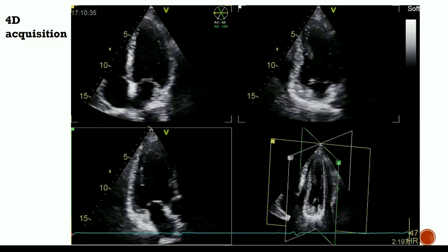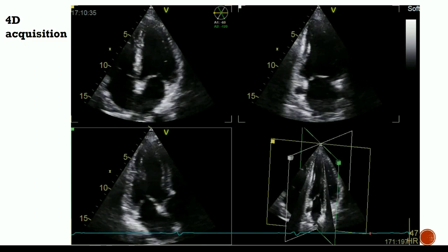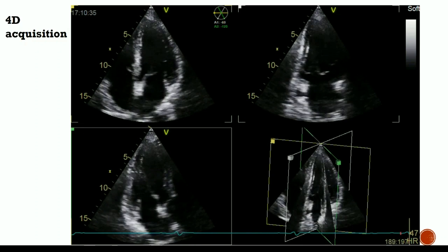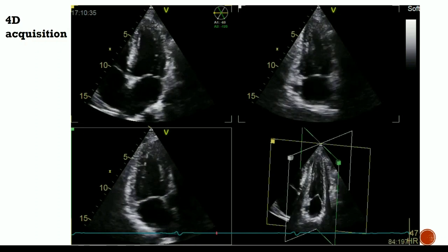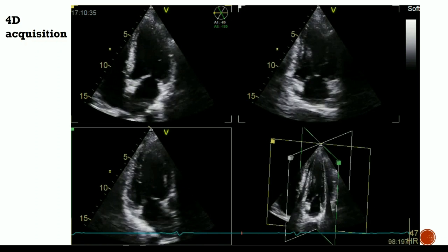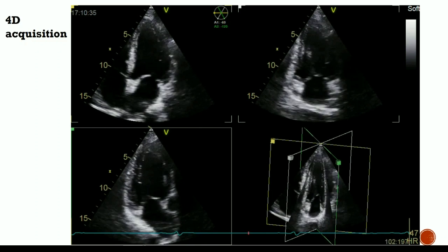Oh, definitely. And they even mentioned that all these vendors are constantly having software updates. Even just a software update may change how they measure it. One of the studies I saw from 2015 compared, I think, 7 different vendors. They all did speckle tracking, but the only speckle tracking that all 7 had in common was endocardial speckle tracking.